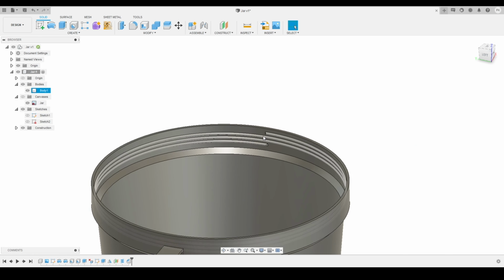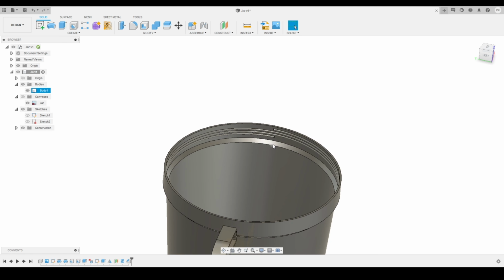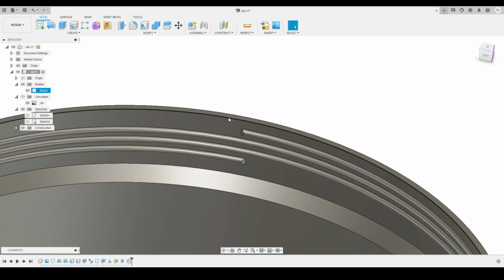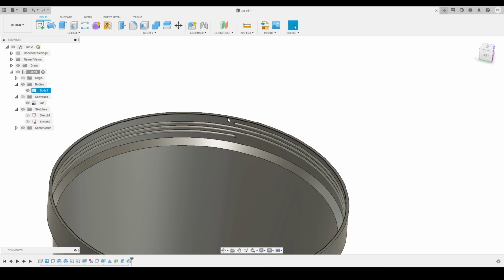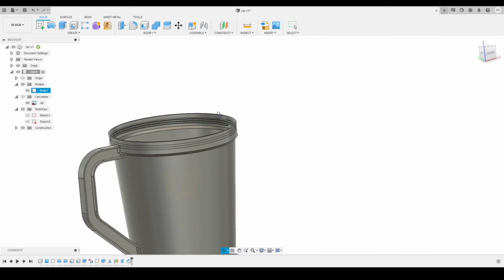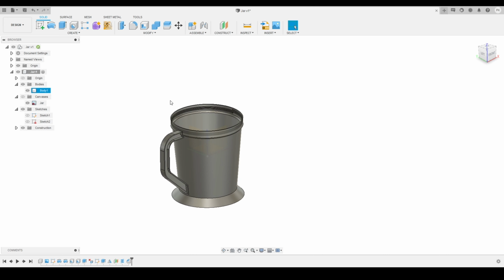So just I think for very small details it is just fine, just leave it like that. Here you can see this is my jar we got. We had just finished this thread portion as well, and this is my final result of the jar with the handle and thread and everything. So this is our first component, this jar component that we had finished, and we'll just click on save here, to make sure that we had saved our file.